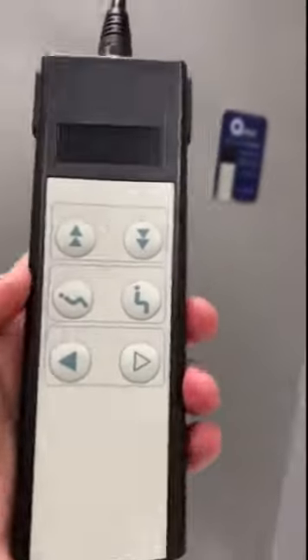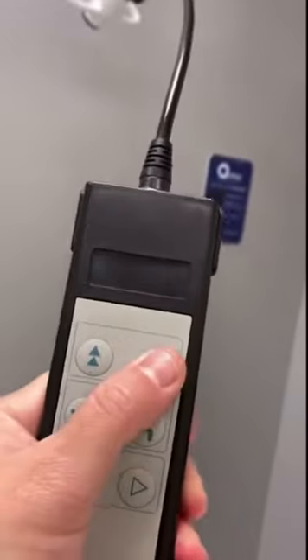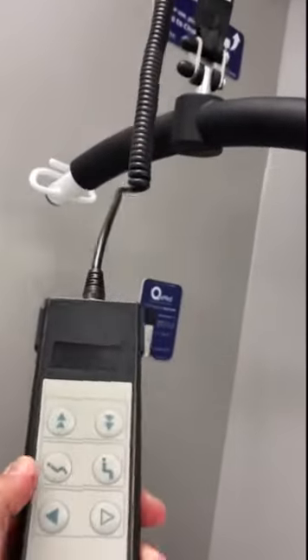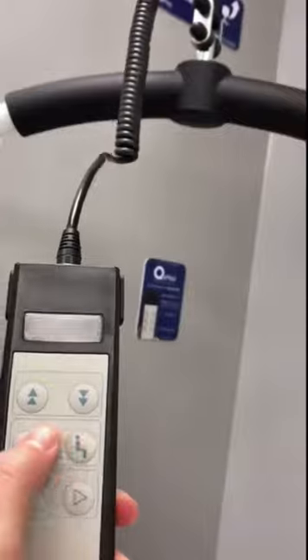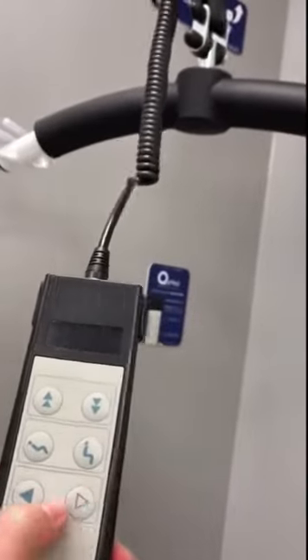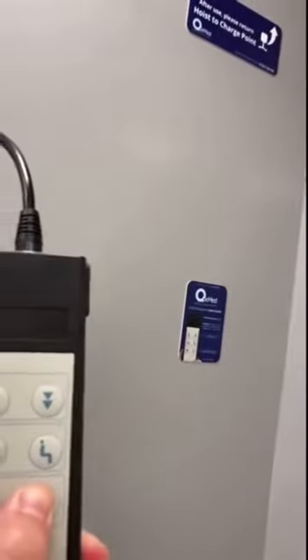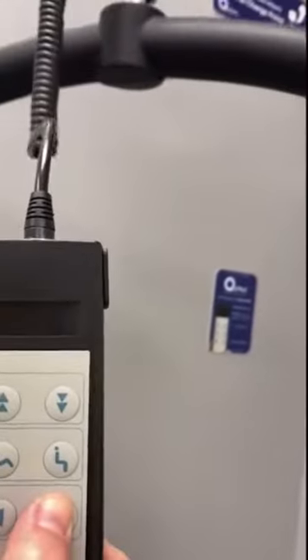The remote is very easy to use — you've got up and down. This middle row is not required; it's for a different spreader bar. This row of buttons is to move across the track, which is preferable when it has a load on it to reduce wear and tear.